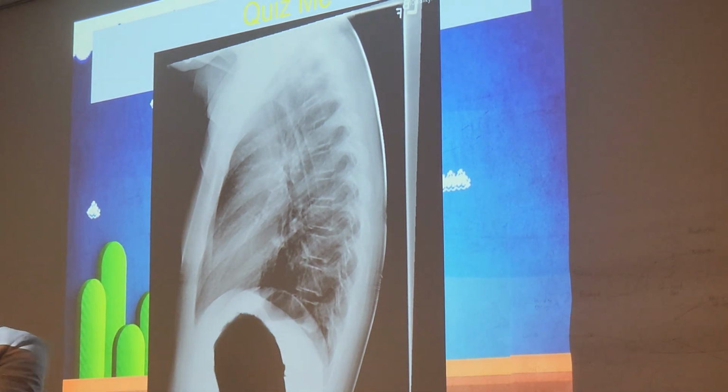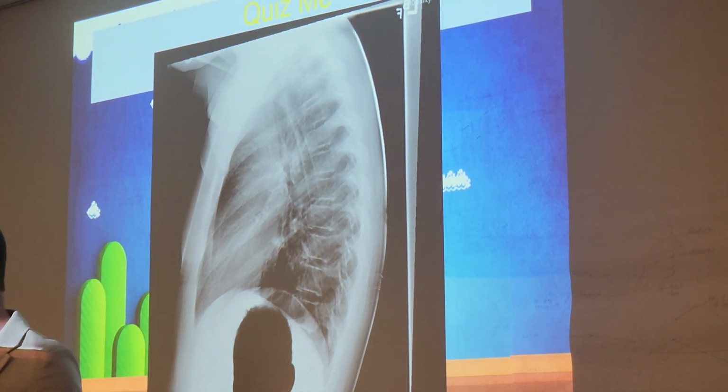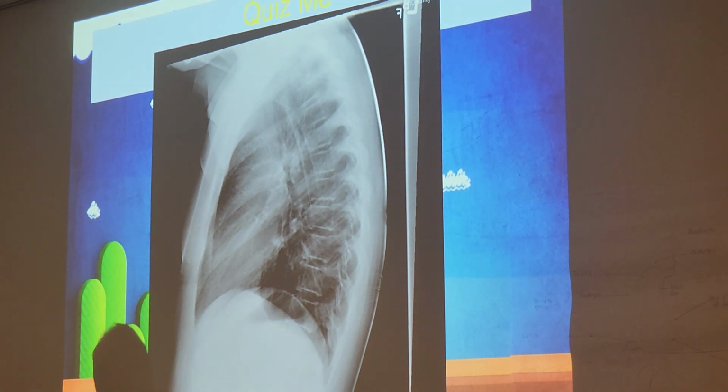The curriculum would say, yes, you should repeat that to optimize that radiograph. Why would I repeat that? What would be my reasoning? Rotation or artifact. Why is an artifact undesirable? It might hide or cover up a pathology.